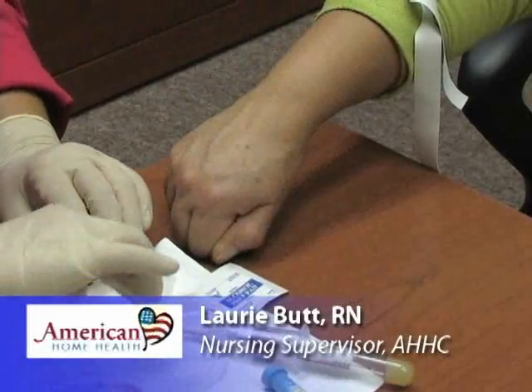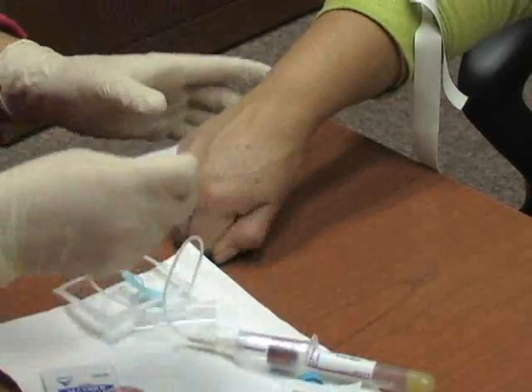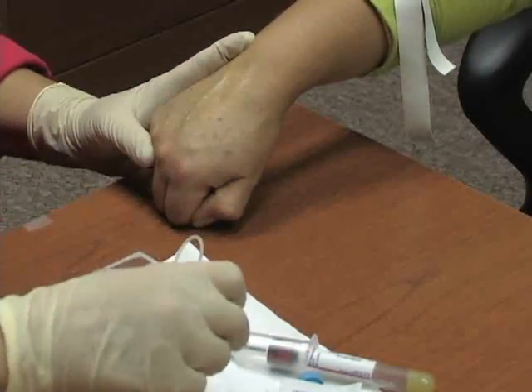Everything is set to go here. I've picked out my vein — it's all sitting there popped up. I'm going to clean it with a little bit of alcohol. You want to make a fist for me? Clean that area and let it dry.